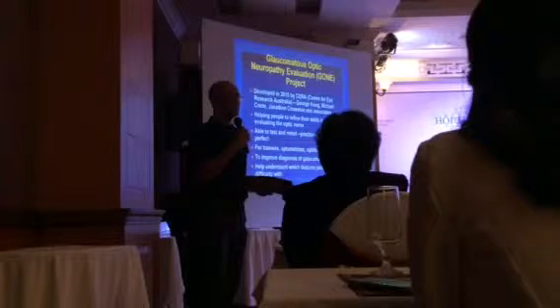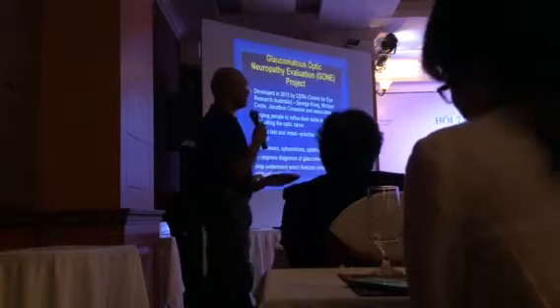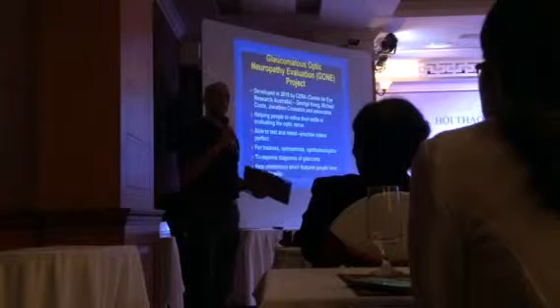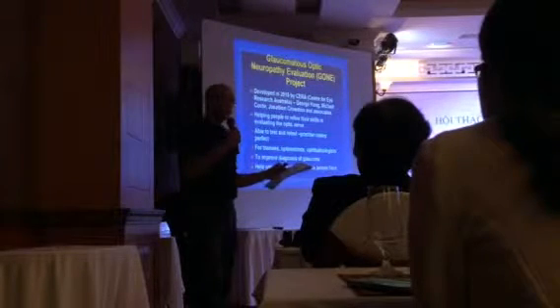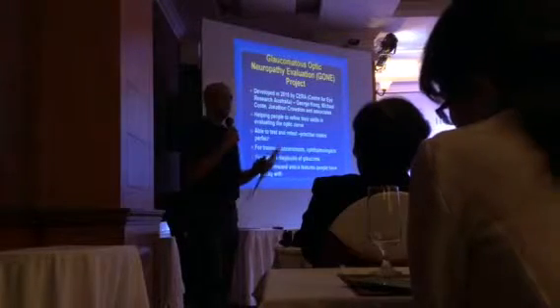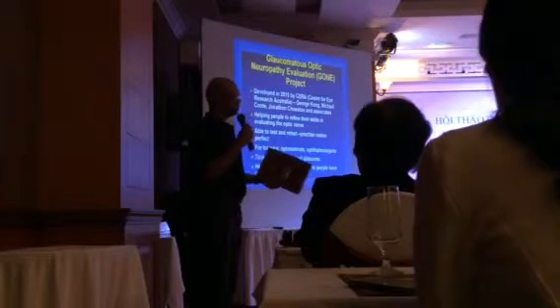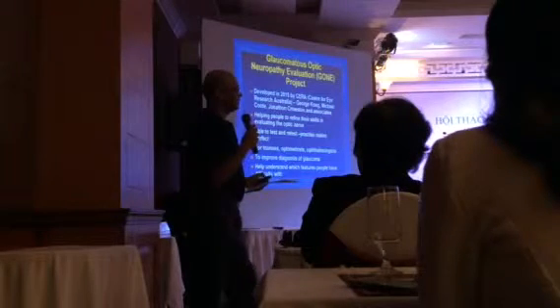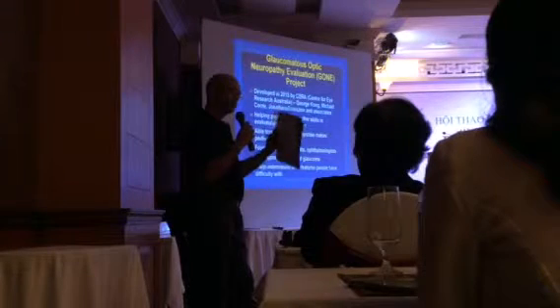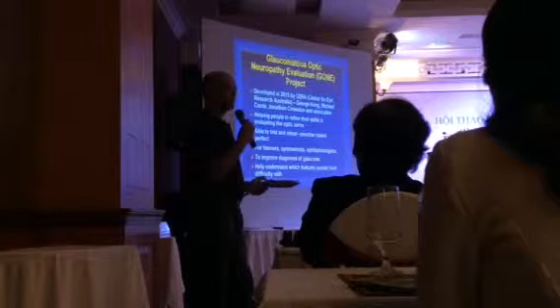And as we heard, practice makes perfect. It allows you to practice until you can recognise all the different features of glaucomatous discs. This helps improve not only the diagnosis of early glaucoma, but also, the other way, helps us understand what features of an optic disc people have difficulty with. There are certain patterns that people really find difficult. We talked about those myopic tilted discs, and determining the actual edge of the disc, not getting confused with the PPA, and determining the size and shape of discs can also be difficult.